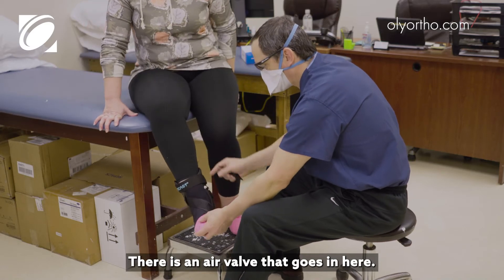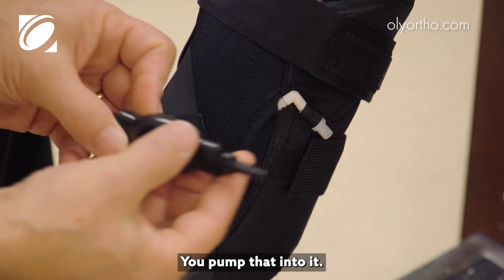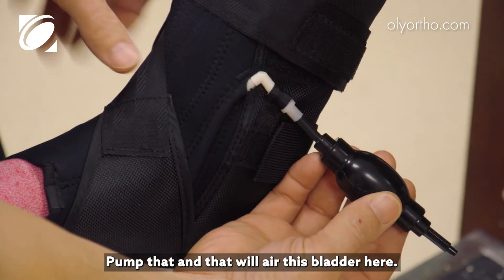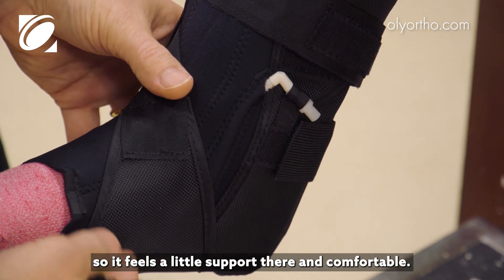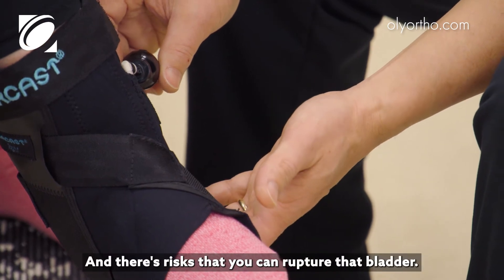There is an air valve that goes in here. It has a little pump — it says inflate. You insert that into the nozzle and pump it, and that will air up the bladder. We want to air it up just so it feels like a little support and is comfortable. If it's too much, that can be painful or difficult getting the shoe on, and there's a risk you can rupture the bladder.